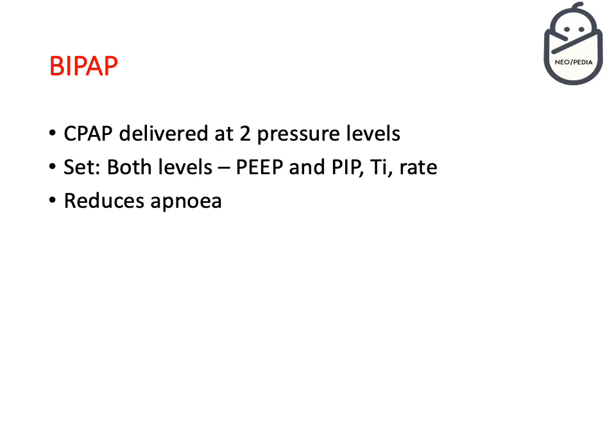Okay, and this will help. So basically, it will be a two pressure level ventilation in this condition. You have to set, for example, you are given PEEP of 6, so this will be your minimal pressure, and this will be continuous basically. The minimal pressure will be a continuous PEEP of 6 centimeter water, for example, and the other pressure will be a higher pressure basically. So it will resemble the PIP, the peak inspiratory pressure.